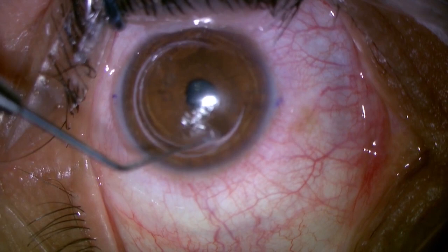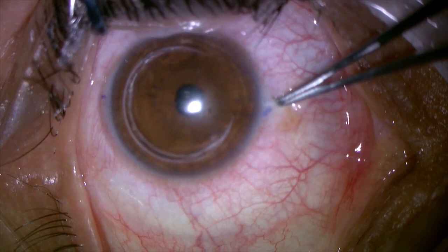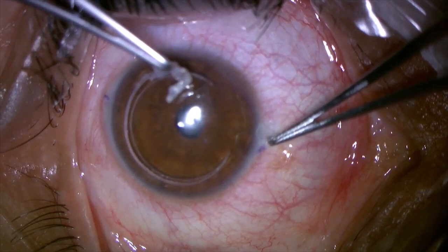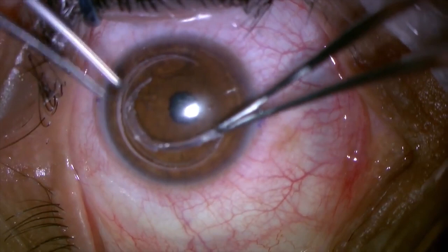And you probably noticed that as I remove the epithelium side, so as you can see, basically the cut is a clean cut. So here, we can remove the resection completely. You can basically peel it off from the cornea, which is beautiful. It is a perfect cut. There's a little tag down here, but we could perfectly peel it off from the cornea. You can see the asymmetrical shape and how it's a perfect resection.